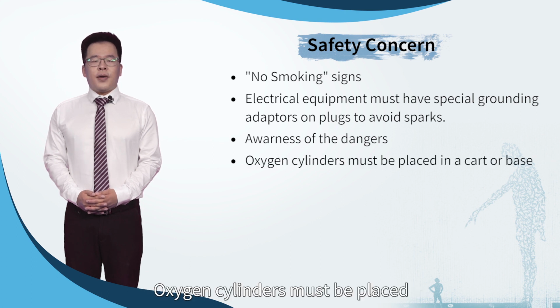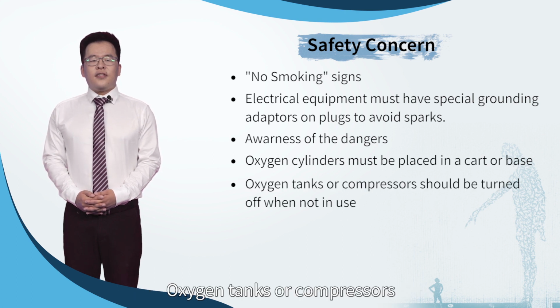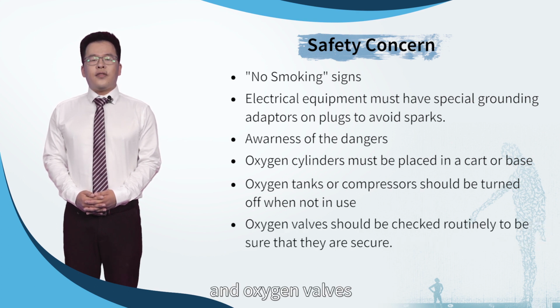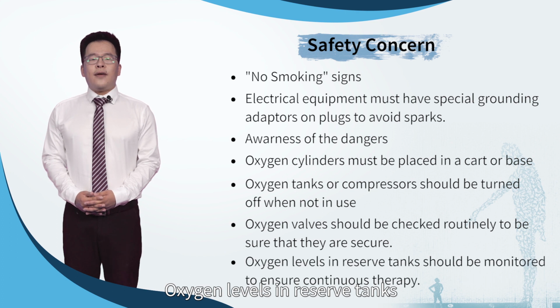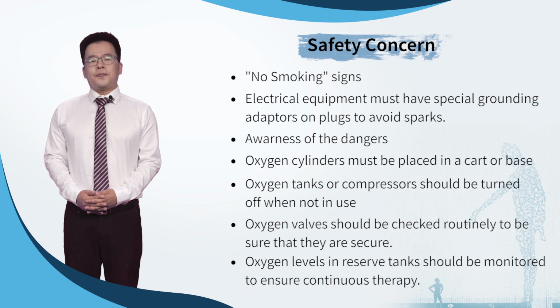Oxygen cylinders must be placed in a cart or base to avoid dropping or bumping the tank. Oxygen tanks or compressors should be turned off when not in use, and oxygen valves should be checked routinely to be sure that they are secure. Oxygen levels in reserve tanks should be monitored to ensure continuous therapy.